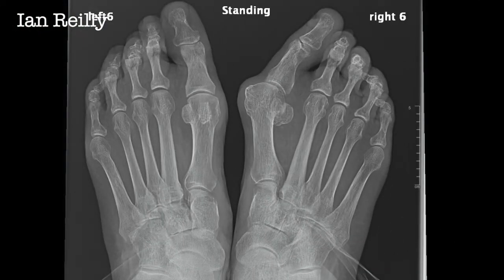Here's a bilateral AP view of the patient. You'll see she's got quite a marked bunion on the right side — in fact I'm going to fix the right bunion for her next year — but her left foot is currently the more painful of the two. The apex of the pain is over the navicular cuneiform joint, which is actually more arthritic radiologically on the right, but it's the left that's currently the hot spot.